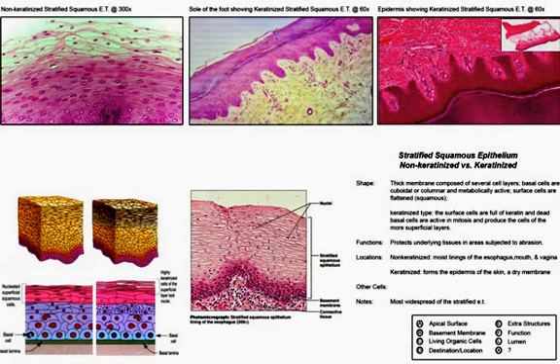These layers again are dead and are constantly sloughing off, and are referred to as the keratinization or keratinized stratified squamous epithelial cells that result from the keratinocytes dying off at this layer. We'll mention that in a moment. This layering right here shows all living cells. So here is our basement membrane. This is a moist body opening.